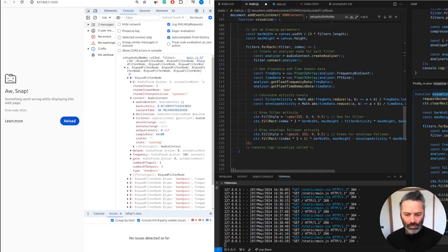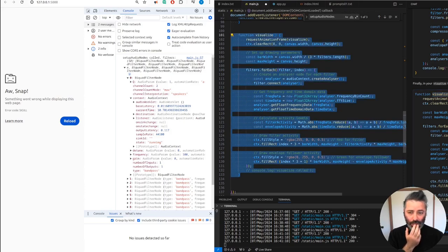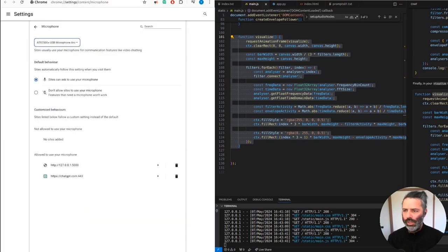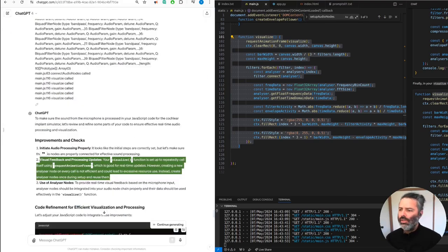Oh snap, problem with the visualize function. You're not creating a new analyzer node. Very cool. Should help with performance. Yeah, we can definitely use better performance. Have something happening, but it's meant to be processing the microphone. So I want to use the main microphone. Something out of bounds. Use of analyzer nodes.